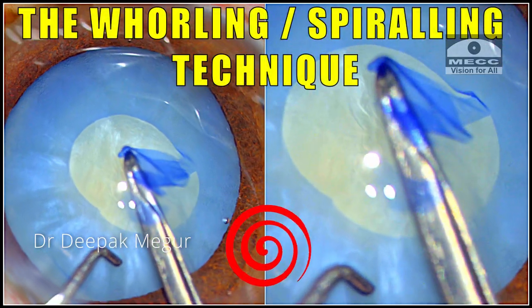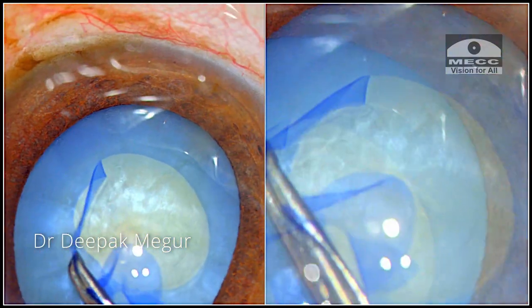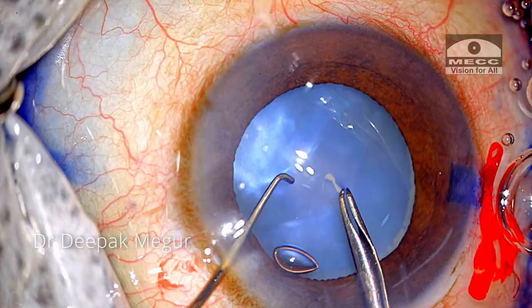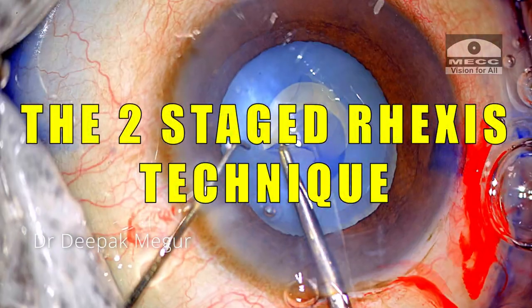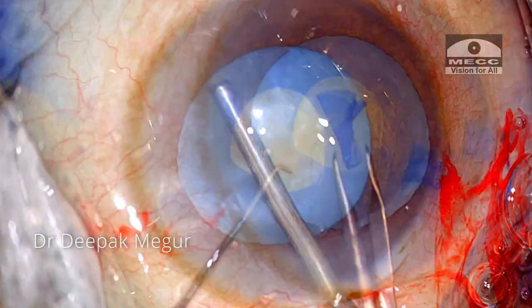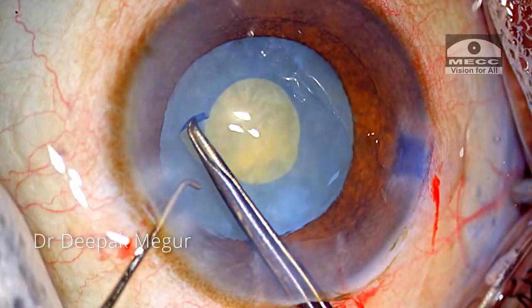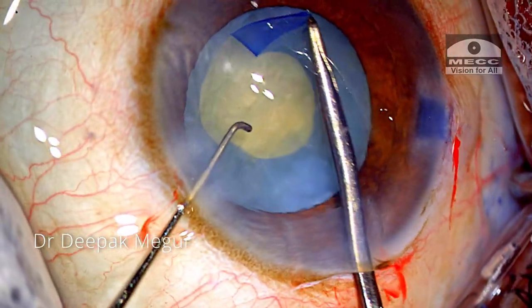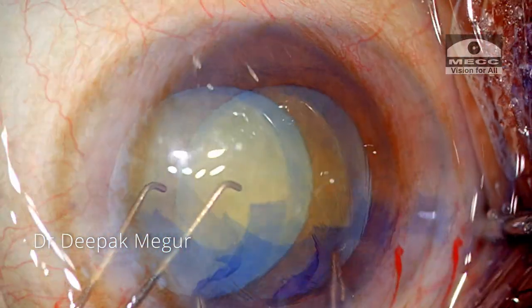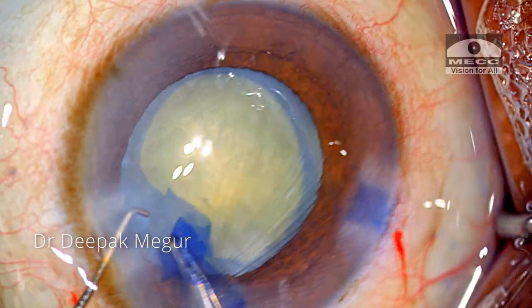Today let us discuss the spiraling technique or the whirling technique for creating rhexis in intumescent cataracts. The two-stage rhexis is my go-to technique for most intumescent cataracts. In my opinion, it is the safest and most predictable way of getting the rhexis right in these types of swollen cataracts — an excellent technique with a high degree of predictable outcomes, up to almost 95% in my experience.